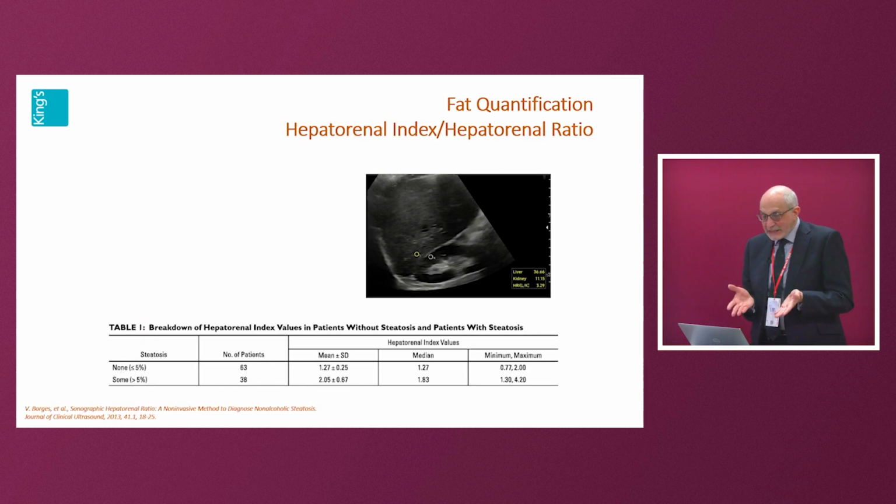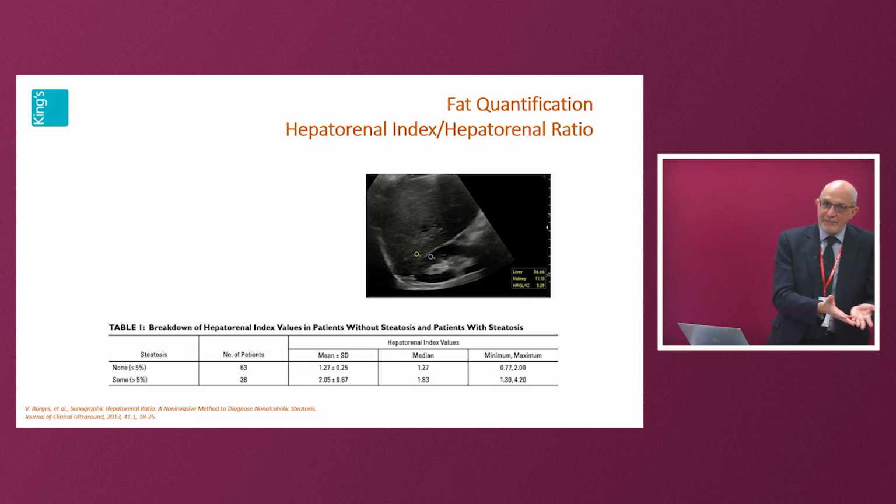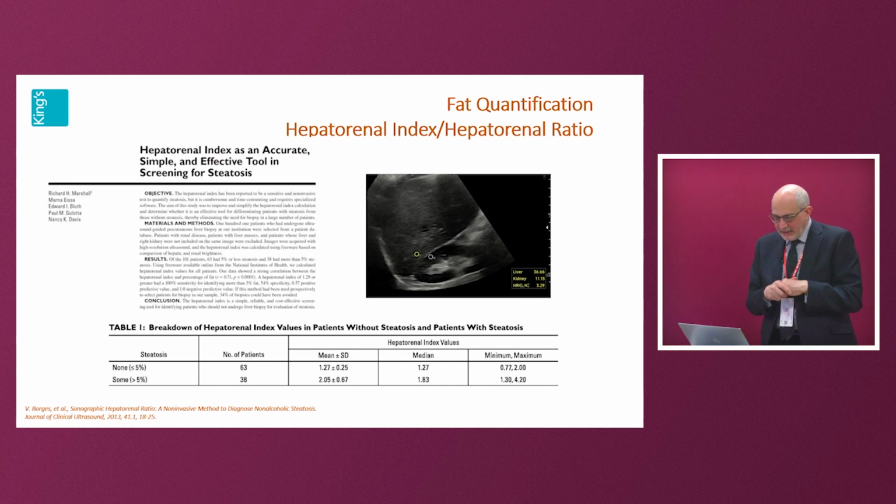So hepatorenal index has been around for some time. People used to take it off the machine, put it on another PC and calculate it. And this paper in the AJR, about 11 years ago, 2013, actually looked at this and quantified it, and correlated it with the fat on histology to give you some sort of figures.